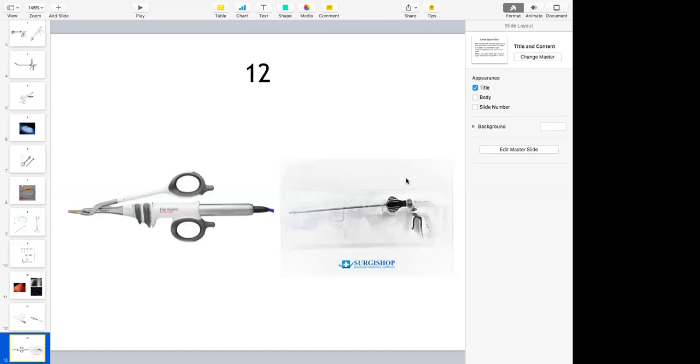Now, what is the use of this torque? This portion which I am showing with my cursor. Torque will tighten the assembly. After you have tightened the assembly, you apply 2.5 rotations on this torque. Torque means rotational force, so that the assembly is absolutely hand tight. And then next, what do you do?